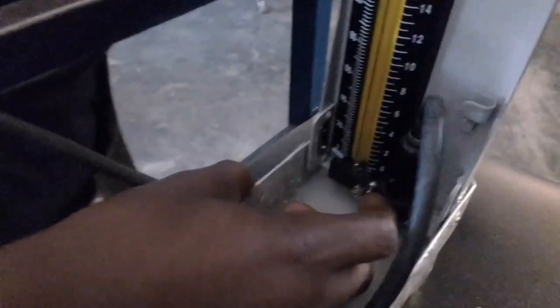And then the same technique we're showing you, ensure that the knob is closed. Then the switch, which is here, has to be turned on. The knob is closed. Then you have to feel for the pulse here. So let me feel as I start pumping. At least I've felt it's pulsating already. It's pulsating, so now I have to pump so that where it stops pulsating, that's where I'll start measuring from.